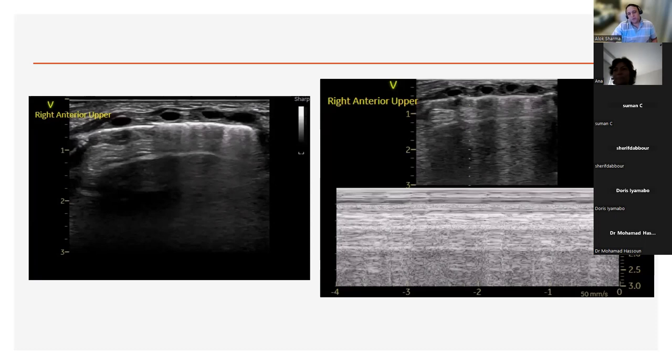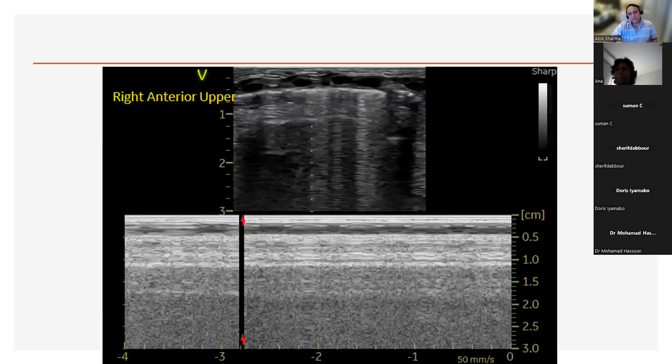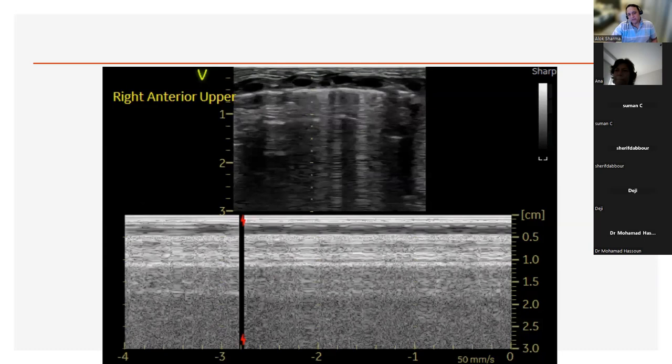Yeah. So what I'd say to you is that this is why clinical correlation is so important. Now, medico-legally, let's say somebody decided to needle this, you'd still get a small amount of air out. The baby would get better. But clearly from your perspective, you've got a small anterior air leak at this particular point. But you're kind of in a situation where this baby doesn't need to be needled clinically with the first scenario. So you're not going to needle the baby, you're going to give it time. But you know there's a pneumothorax that could get worse.